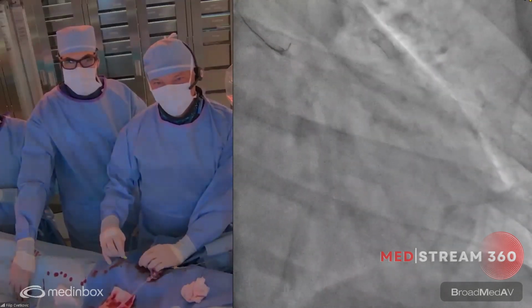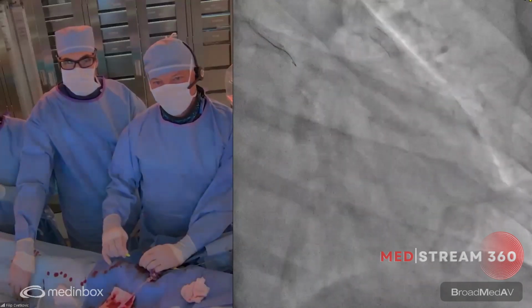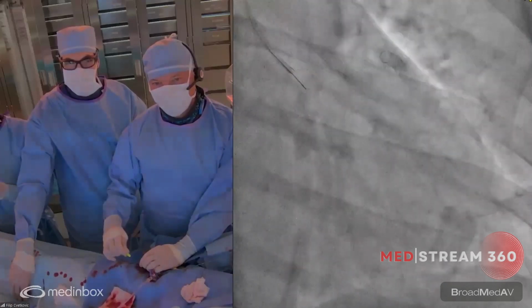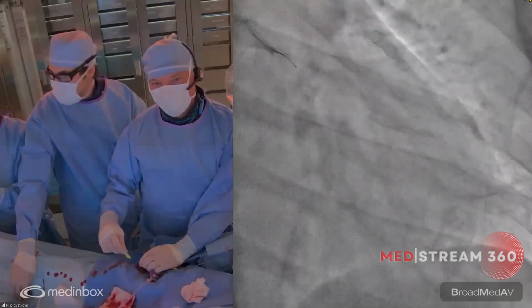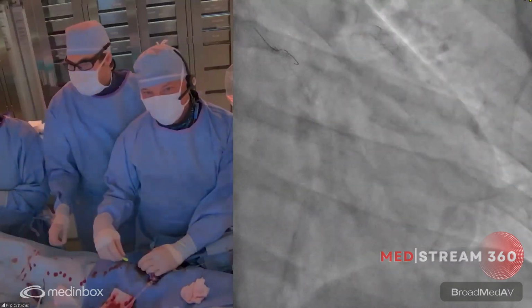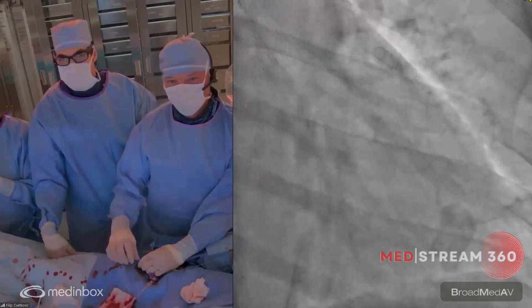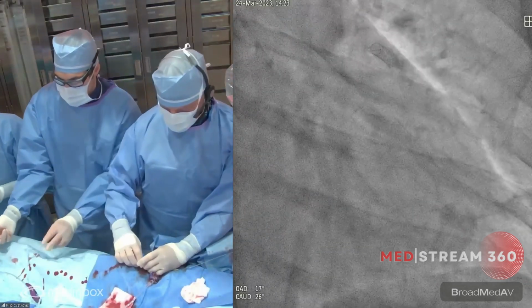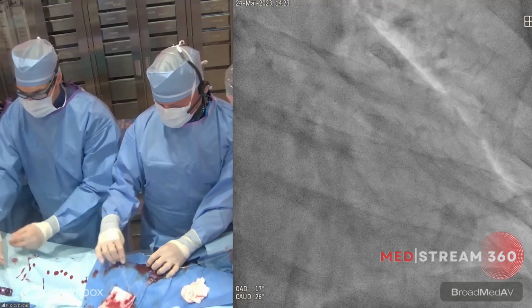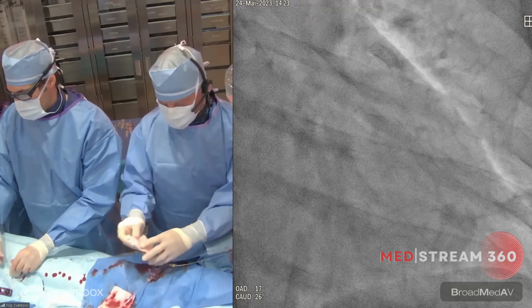This one is a Pilot. I think it has a good, safe approach. Fielder could be another option also. Hydrophilic polymer jacket wires are very good at crossing those recanalizations. So I think we'll try the Fielder XT. It's interesting that the patient had no real chest pain except initially in the back, but then after that, crushing pain in the chest. So let's go with the Fielder XT.